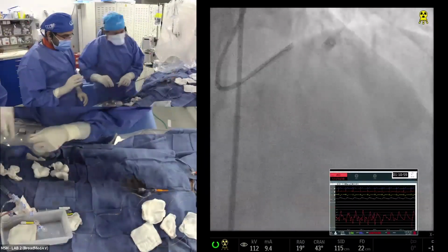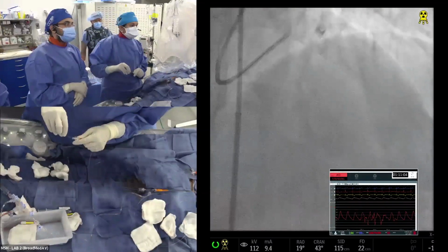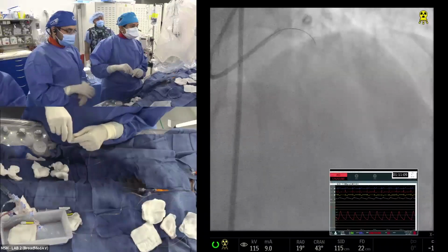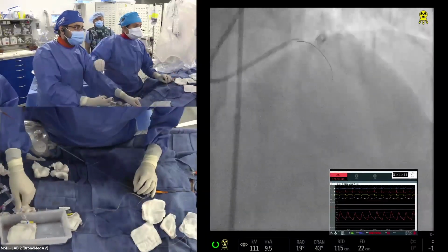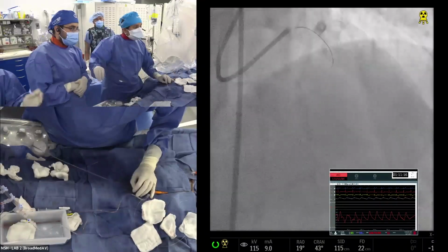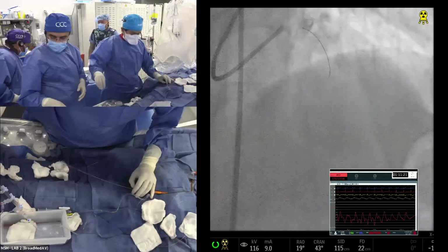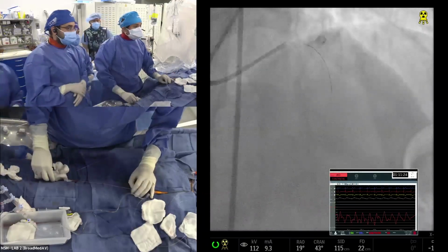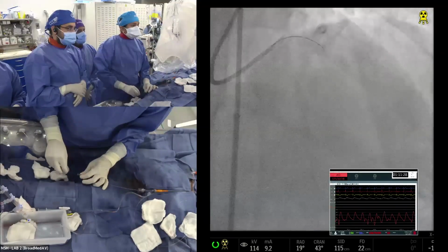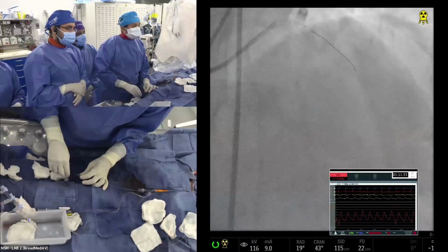In rare situations, your side branch has significant disease, is angulated, and access to the side branch is harder. You may have to do the side branch first and then go to the main, because the main usually is a straight approach. That's our strategy. It will also depend on the tightness of the side lesion. As a rule, whichever is more difficult is done first, and the simpler one is done later. Yeah, that's correct.